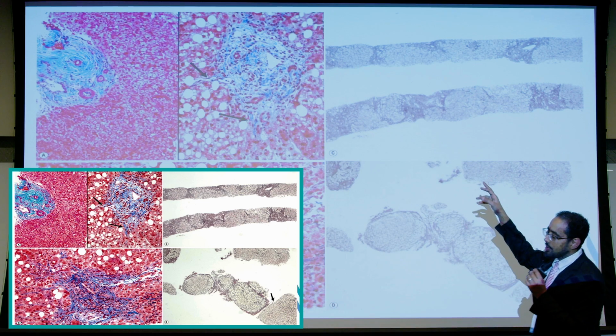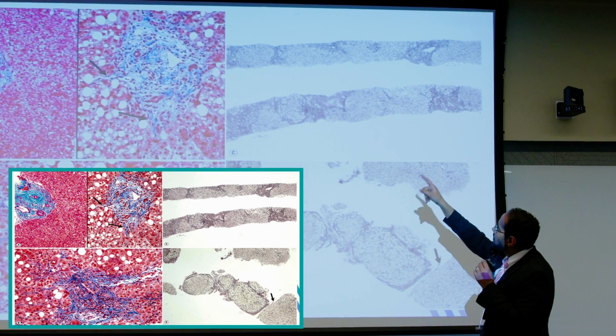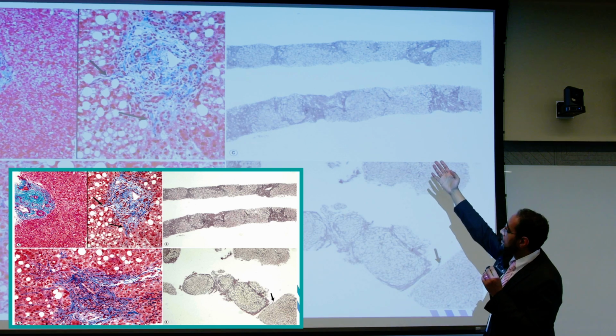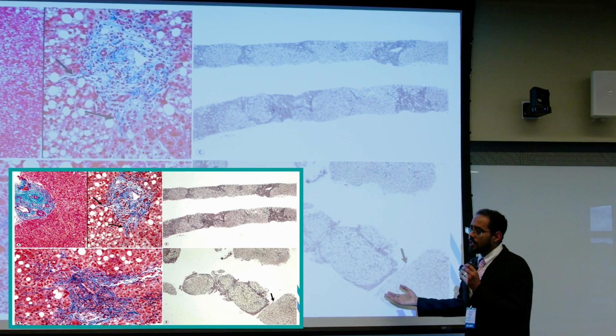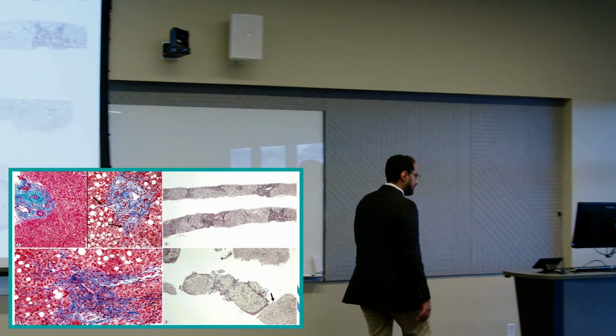And then this is what we call a reticulin stain, which also shows the fibrosis. You can see it has started to become slightly nodular because the fibrosis is going all the way and making nodules. This is stage 3. And this is a cirrhotic liver, which is stage 4, which is very difficult to see on a core biopsy, but I'll show you another picture.